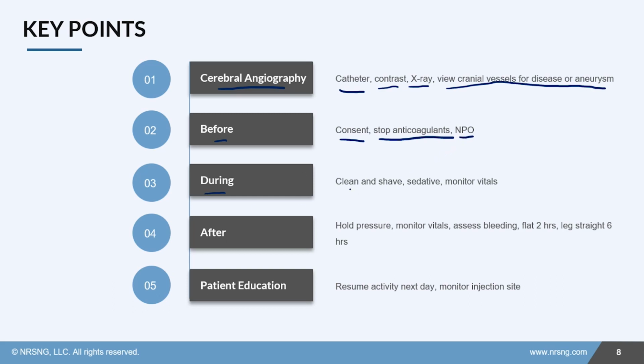During the procedure, you're going to clean and shave the upper leg and groin area. You might provide an IV sedative to the patient to help them relax, and then monitor their vital signs during the procedure. After the procedure's over, go ahead and hold pressure on that site.